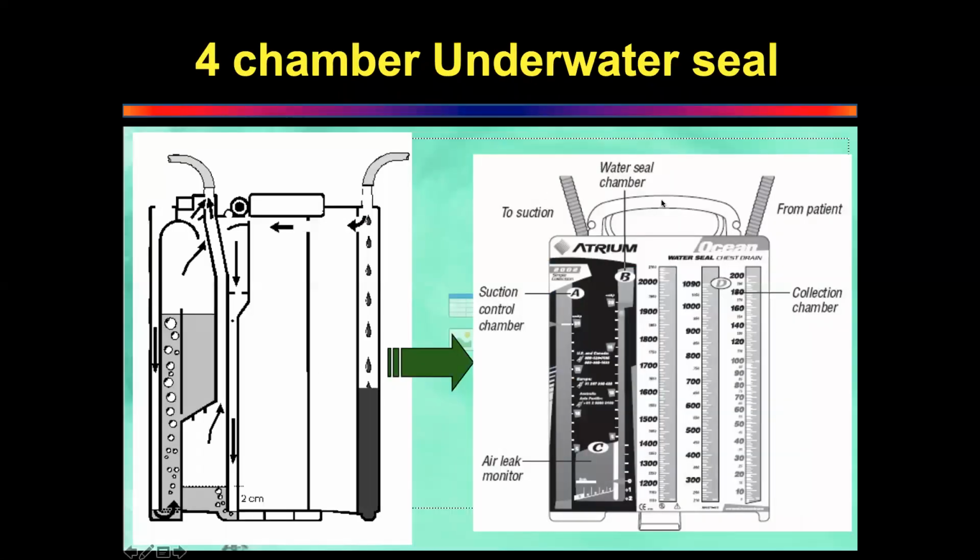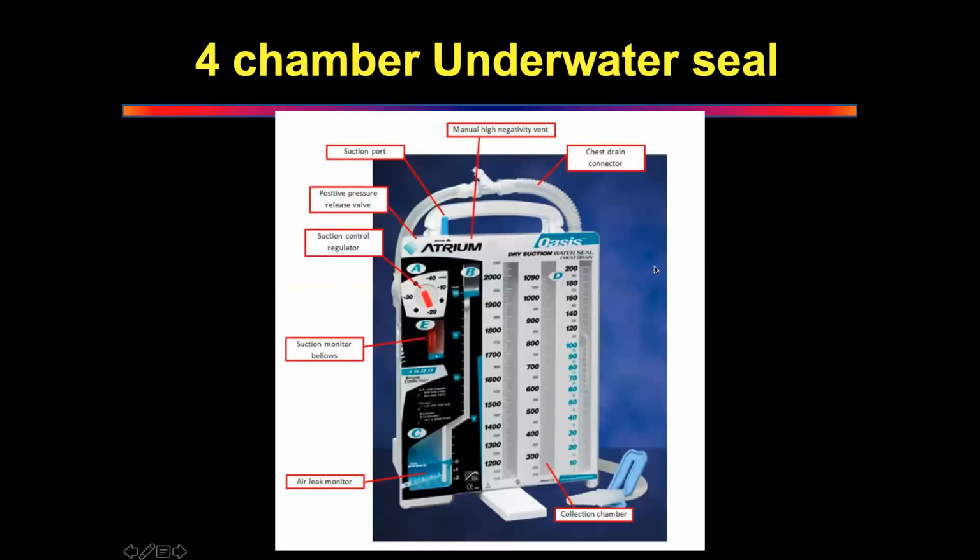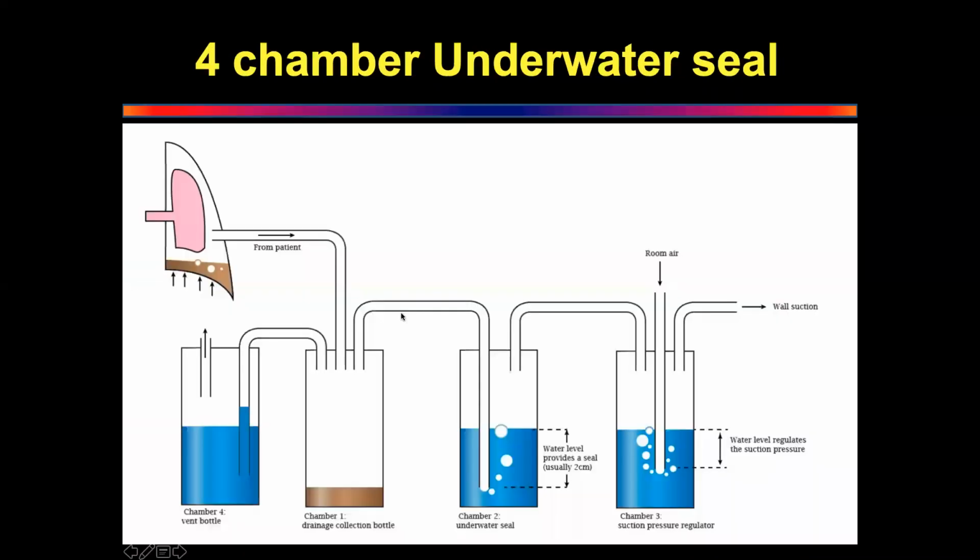So this, the Atrium, is a 4-chamber bottle. Atrium is a 4-chamber bottle, and I drew all of this for you just so that you understand what is happening.